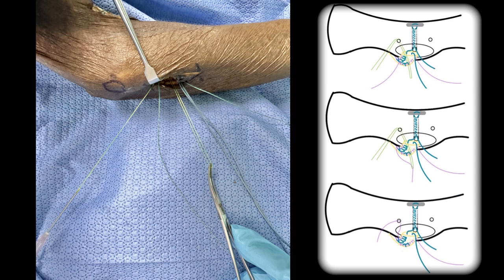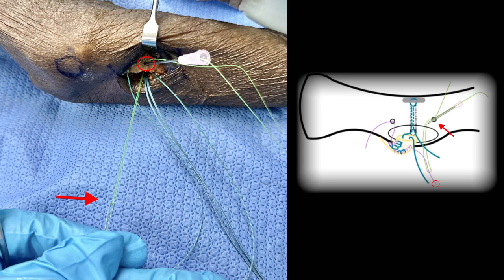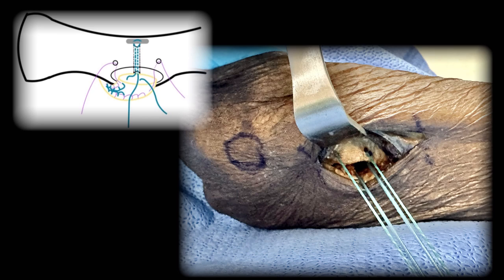The next step is to pass the fiber wire number 2 through the bone tunnel on both sides. So start with passing PDS number 1 first for shuttling the fiber wire number 2 to each bone tunnel on the side. The lateral stump, which is the long head, goes to the proximal bone tunnel, and the medial stump, which is on the short head, goes to the distal bone tunnel.